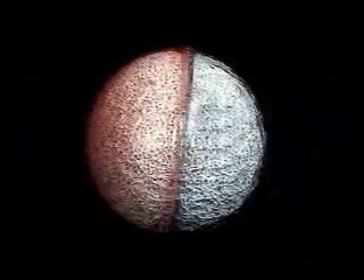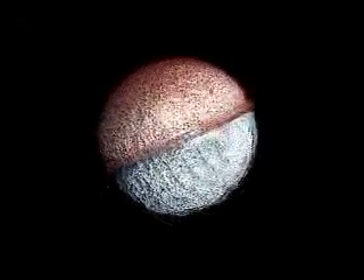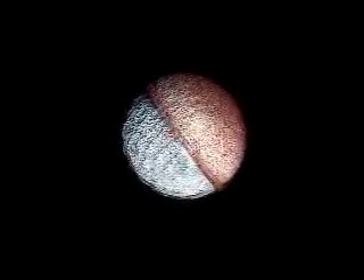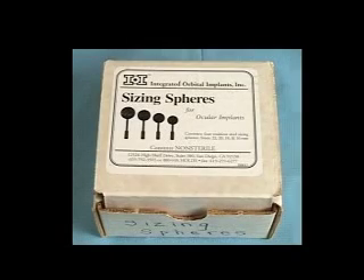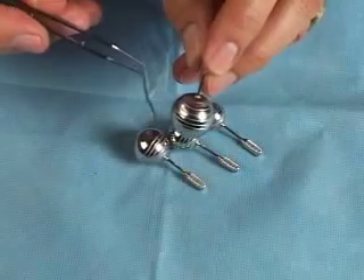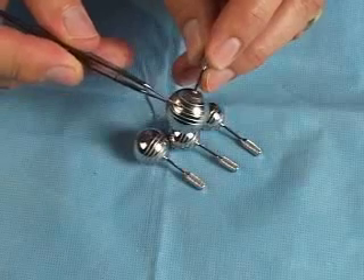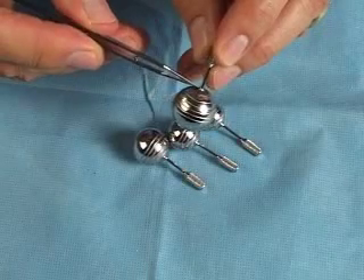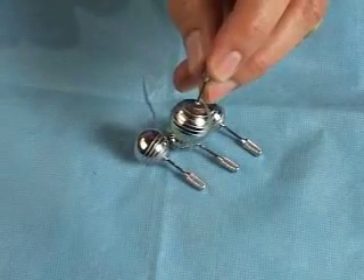Now let me discuss the techniques I use when inserting the coated Bio-I implant in an enucleation, evisceration, or as a secondary implant. Once the standard enucleation has been done with the muscles tagged with a double-arm 5-0 Vicryl suture, the socket is sized using sizing spheres. Select the largest sized implant that when placed deep into the orbit can be covered without tension. The rings on the sizing spheres help locate the approximate location of the muscle windows. Keep the largest sizing sphere in the socket while the implant is being prepared, as this helps keep the socket from swelling and keeps the space open for the implant.